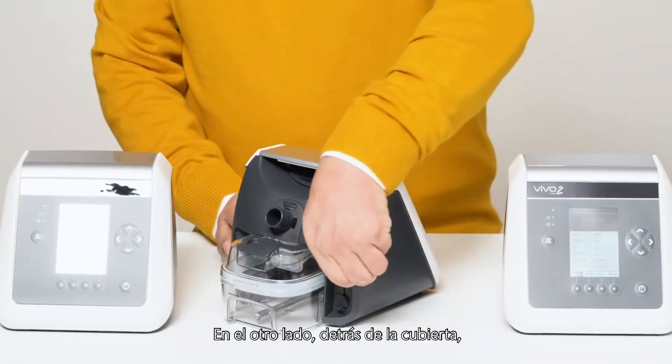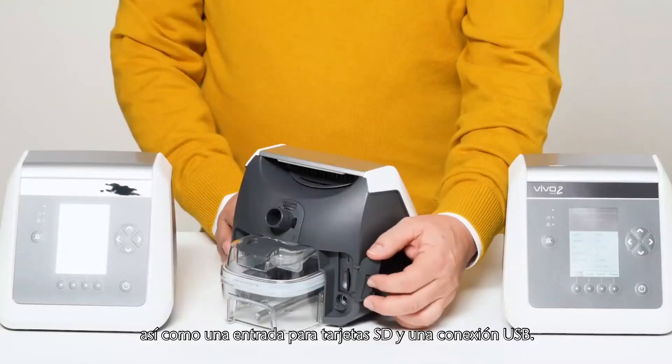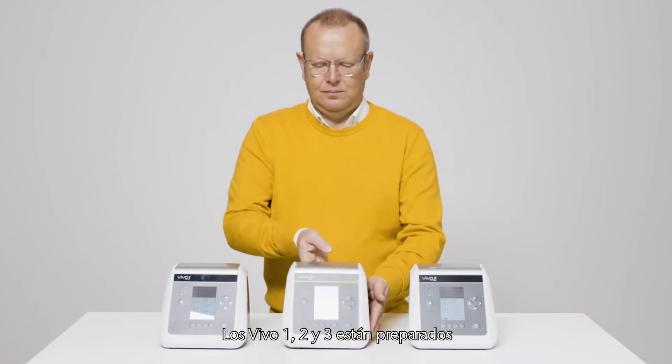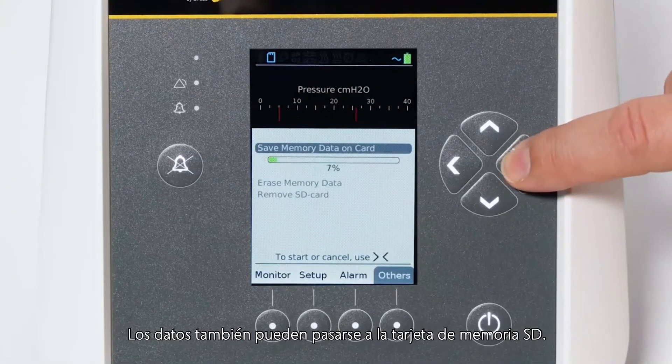On the other side, behind the cover, you will find the connector for the accessory box, as well as the SD card slot and a USB connection. The Vivo 1, 2 and 3 are prepared for connection to the BreaS cloud solution, but data can also be transferred on the SD memory card.